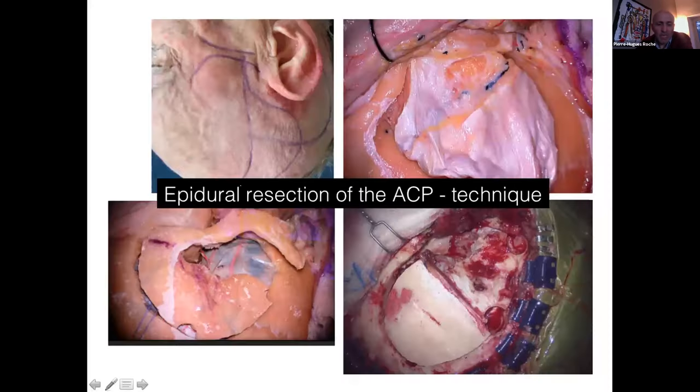Okay, depending on what you want to do inside, the skin incision may vary. If you want to go for an FTOZ, a full one, you will do this kind of question mark skin incision, particularly if you want to combine your surgery with a Kawase approach. Otherwise, if you go for a regular pterional approach, the regular traditional skin incision is more than enough.